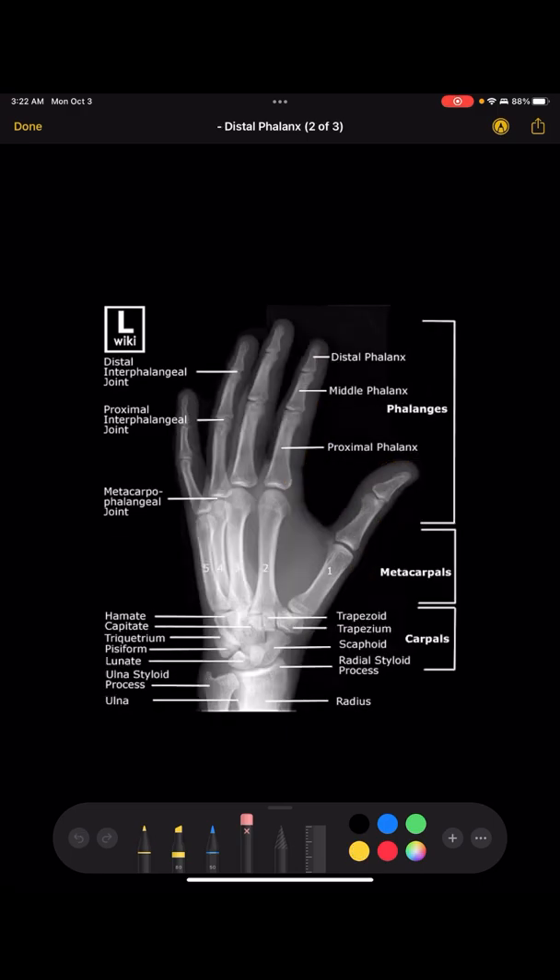For the oblique hand, it's a 45-degree angle. The way you can tell you didn't over-rotate or under-rotate is that the concavity will be slightly different from the PA. Make sure the fingers are separated — the soft tissue shadow should be distinct. The key indicator of perfect rotation is that the 3rd, 4th, and 5th metacarpal heads will be slightly overlapping each other but with a little bit of space in between them.